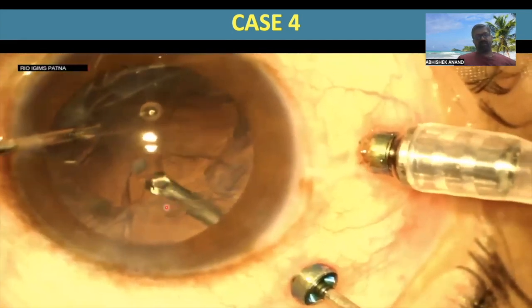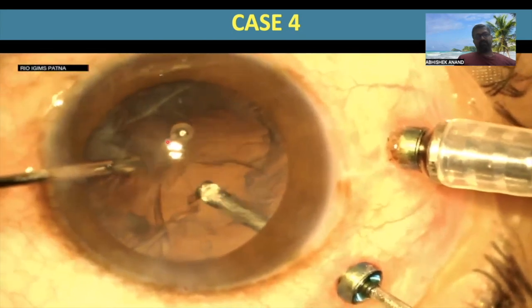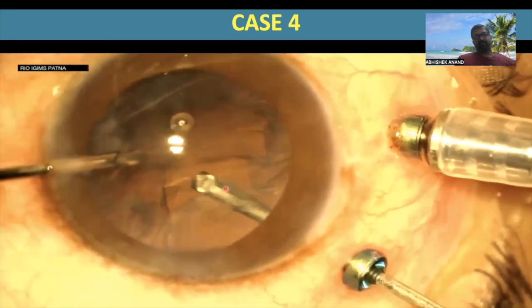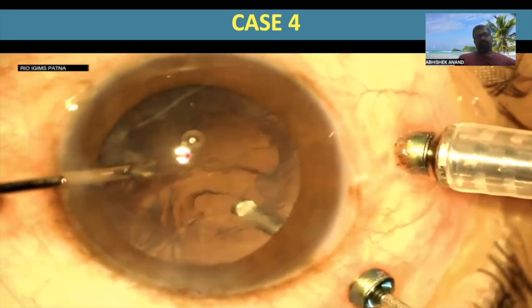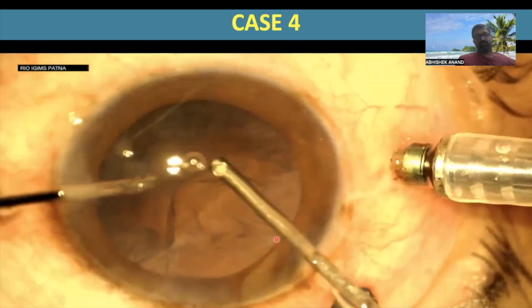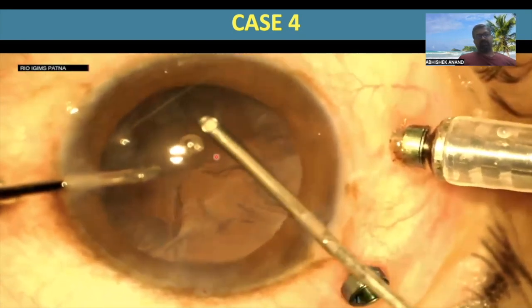This is a triangular rent that is present. And we are aspirating the prolapsed vitreous through it. So all the prolapsed vitreous that has come into the anterior chamber is aspirated back. But an anterior segment surgeon can also do the same by introducing it through a side port incision. So here is the infusion port and here is the vitrectomy probe.